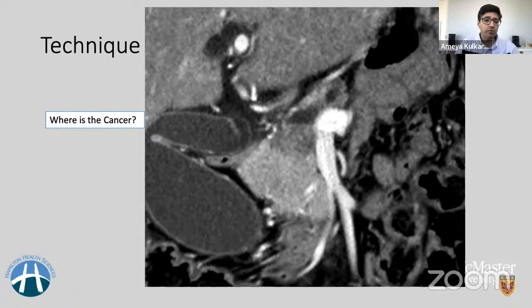What is the volume? It's usually around 100 to 150 milliliters of high density non-ionic intravenous contrast, and it should be injected anywhere between 3 to 5 milliliters per second. We usually inject at 4 ml per second, but we also follow that with 20 cc of normal saline flush. That's just our acquisition technique. Now the images have to be acquired in helical mode, and it should be 0.5 to 1 millimeter thickness with similar slice gap, but you can reconstruct them as per your institutional protocols. The coronal and sagittal reconstruction could be anywhere between 2 to 3 millimeters thickness.